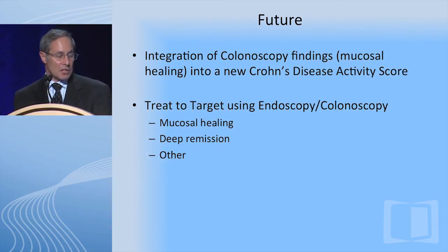The future may also include the integration of colonoscopy findings, such as mucosal healing, into a new Crohn's disease activity score. Certainly, treat-to-target strategy using endoscopy, colonoscopy with targets of mucosal healing, deep remission, and others will be part of the future.